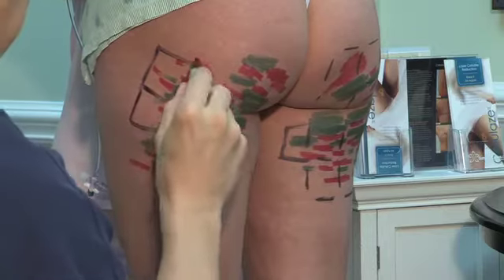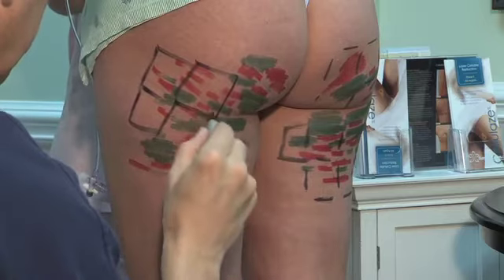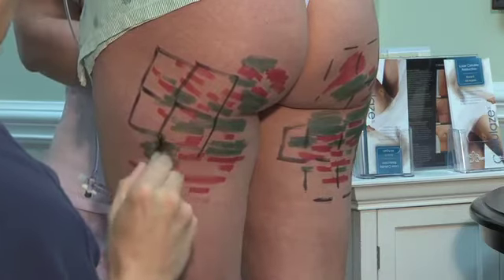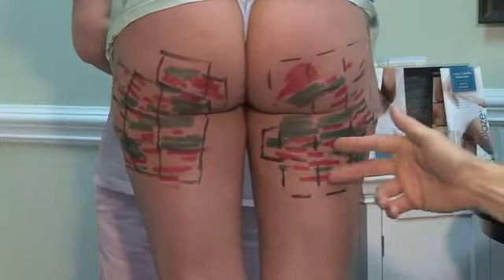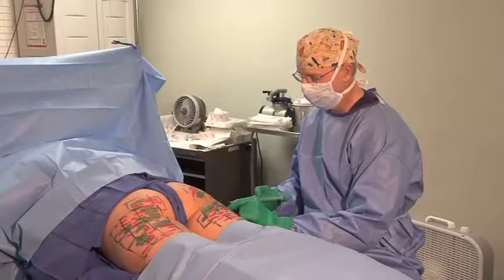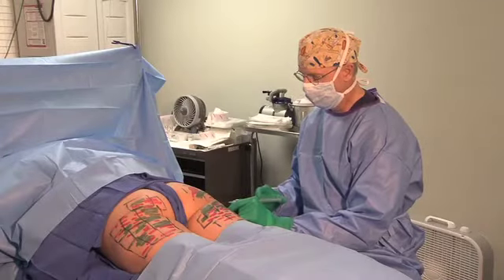With this particular patient, there are areas of contour that we're going to be addressing. At the same time, you can see the overlying cellulite, which is a more superficial kind of structural change in the skin form. So in her particular case, she's that mid-range patient. The most dramatic results, obviously, are in the patients who have the most dramatic amount of cellulite. In those mid-range, though, the changes that occur are probably the best in that they really achieve the smoothest skin texture. This kind of procedure we're doing under a local with a little bit of sedation. It makes the patients very comfortable.